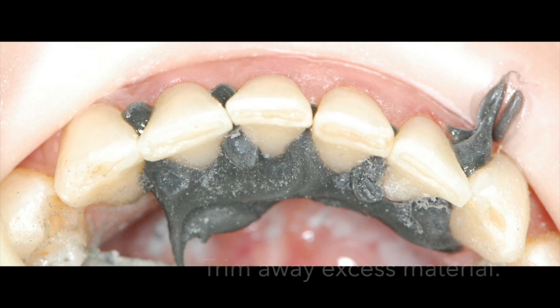I take a football-shaped diamond bur to trim back the excess and brush back the polyvinyl material to the CEJ of the adjacent teeth.